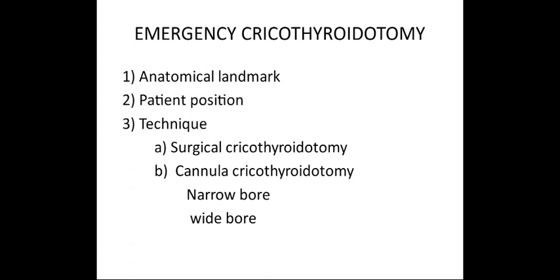Start pressure regulated jet ventilation. It requires jet ventilation using a high pressure ventilation source, and it is associated with barotrauma. That means pneumothorax and pneumomediastinum can occur. This technique requires the patient's upper airway for exhalation.